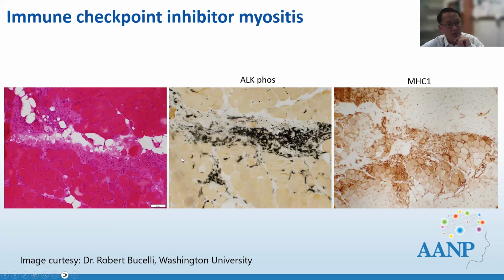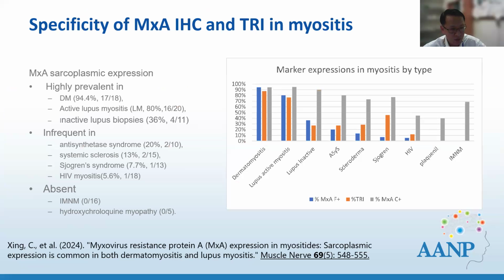Okay, so that's all the 5 differentials that I want to talk about. In real practice, if you don't have the history, these all present as very significant challenges. I also want to mention the staining of MxA, which is right now considered a very specific marker for dermatomyositis. I have done my own study, which looks at its expression in a wide range of overlap myositis, because I've seen tubuloreticular inclusions in almost all of them.